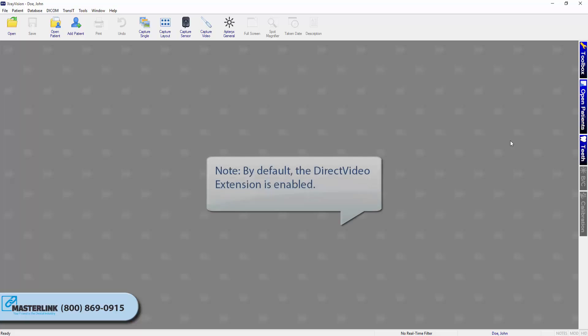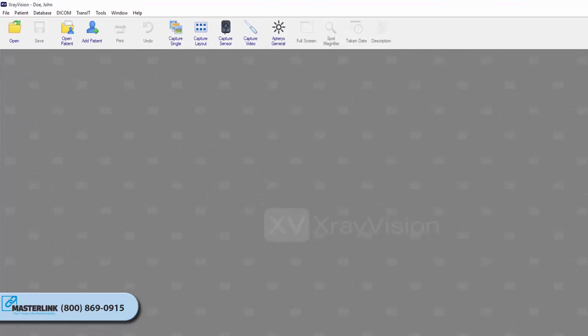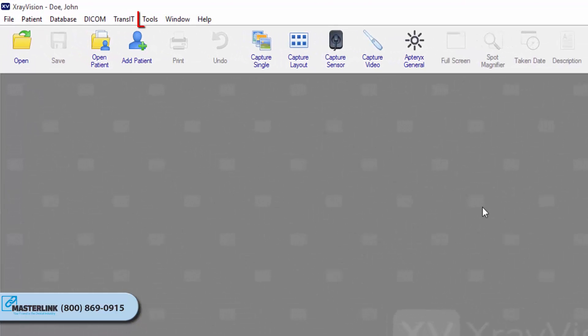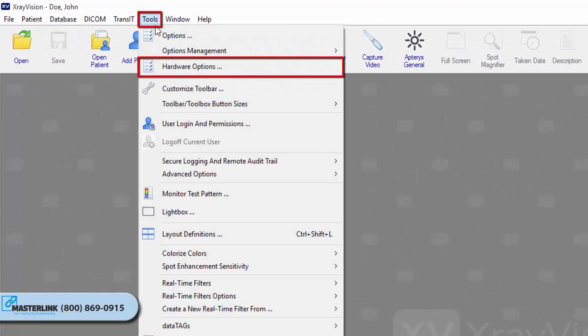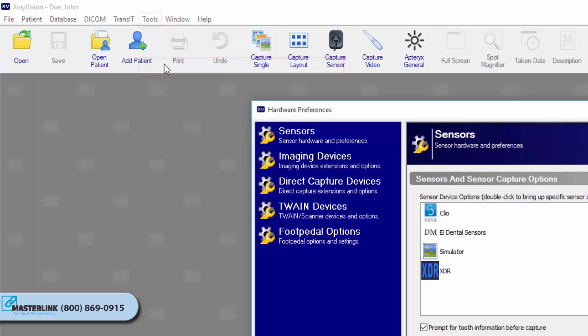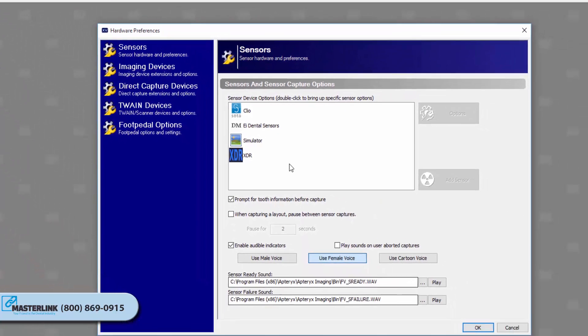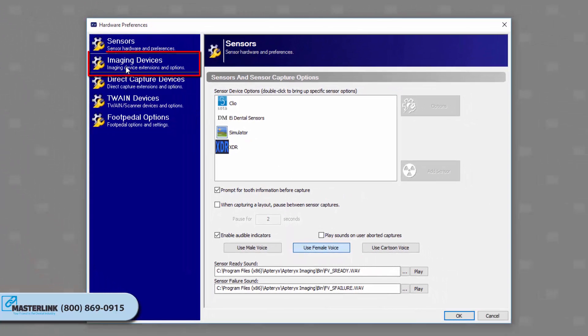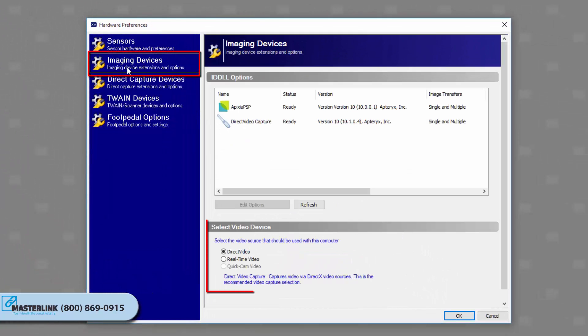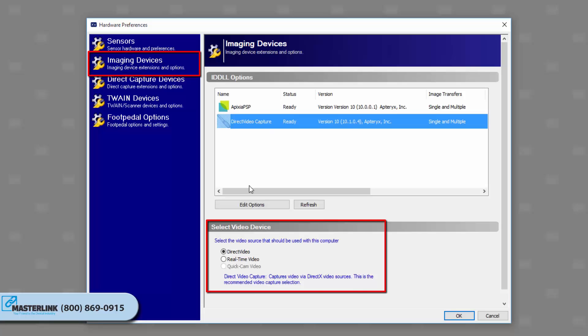Note: by default, the direct video extension is enabled. To change to real-time video extension for older analog cameras, click on Tools, Hardware Options, Imaging Devices, and enable the Real-Time Video option under the Select Video Device category.